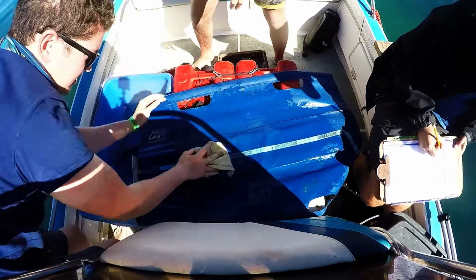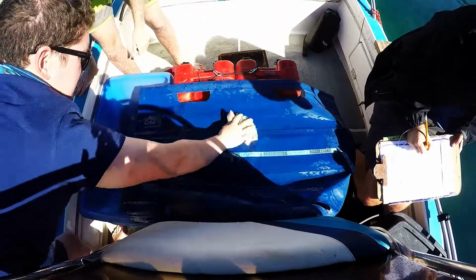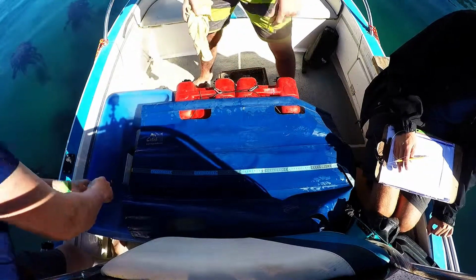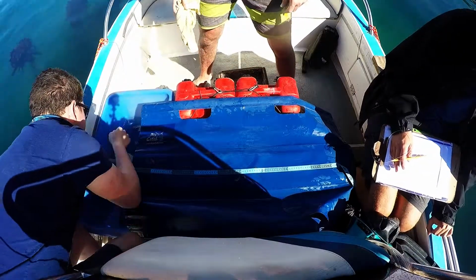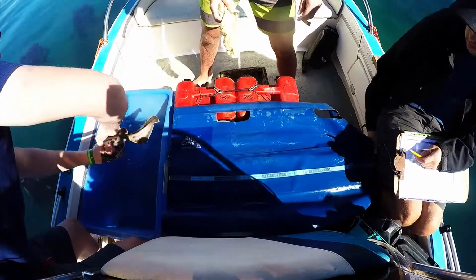When handling sharks, it is important to make sure that the work surface is wet so as not to cause the animal undue damage or stress. The correct way to handle a shark is to place one hand behind the pectoral fins and grip firmly, and use the other hand to secure the tail.